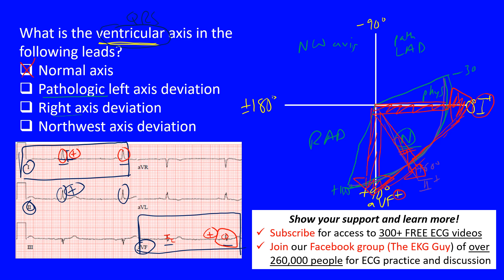What we have here is a normal ventricular axis based on those findings. The question is, what is the ventricular axis in these following limb leads? That's a normal ventricular axis. That's the end of this lecture; I hope you learned something.